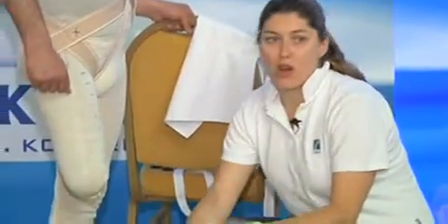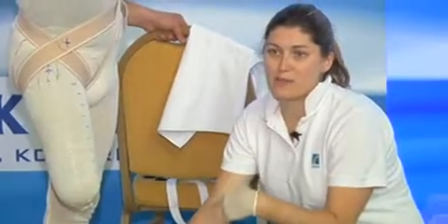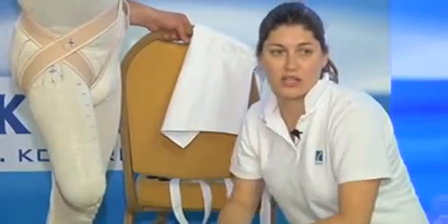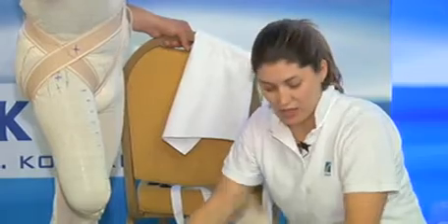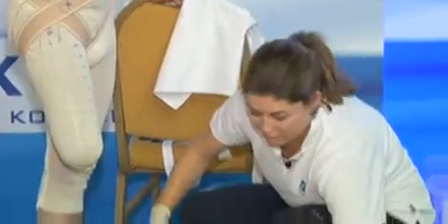Now, sometimes when you're alone, it might be good to put the slabs on at the end so that you can do it quickly, so that it doesn't harden. Because I've got Isak here to help me, we can do it a little quicker.